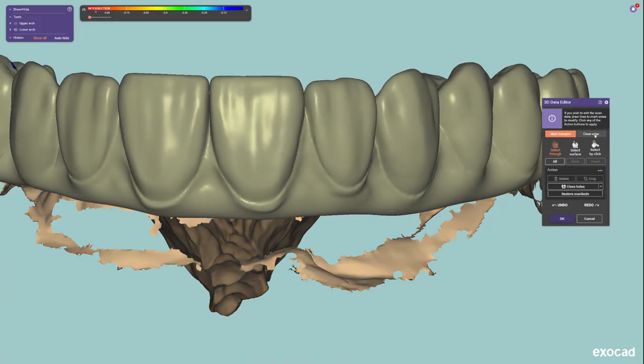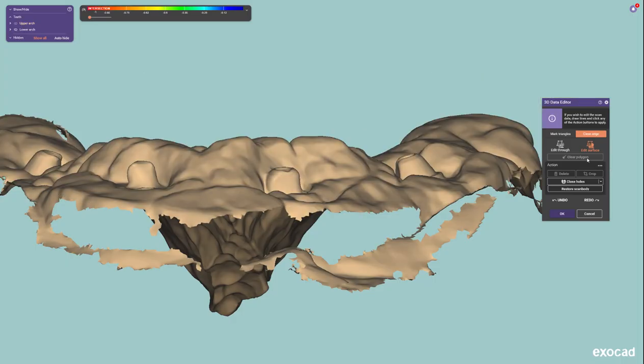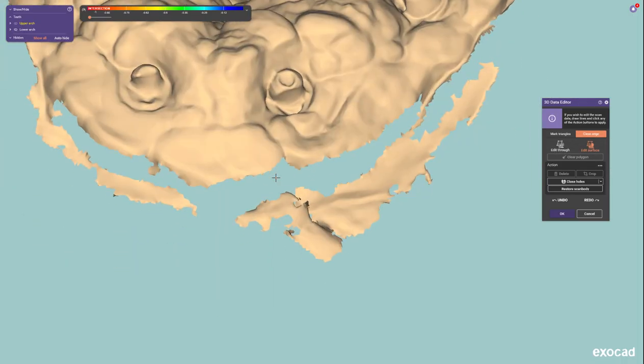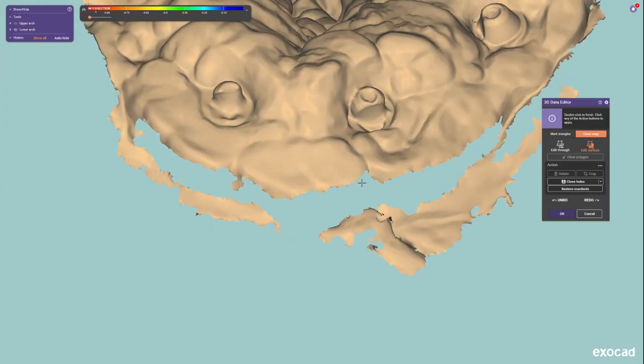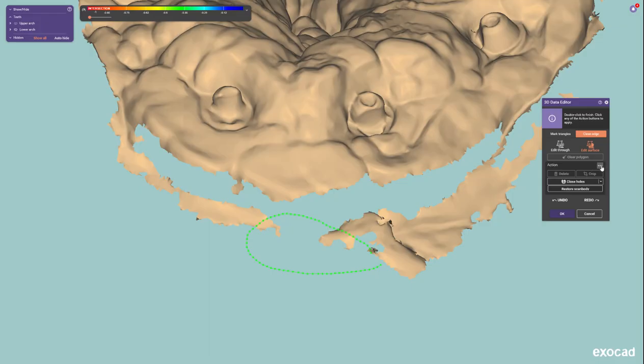So they have this new feature called clean edge. I'm going to go to edit surface, not edit through—that's an important piece of this. Then I'm going to select this area here and now I'll come over to bridge gap.